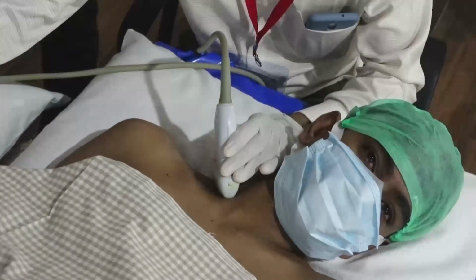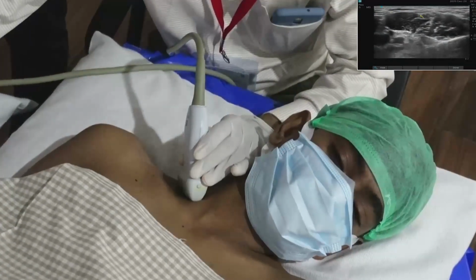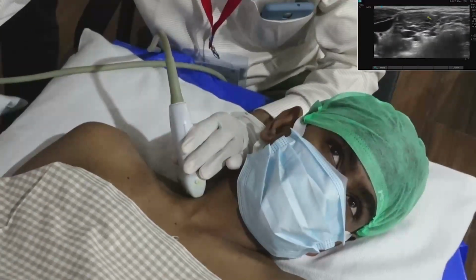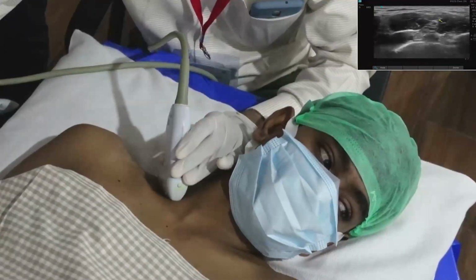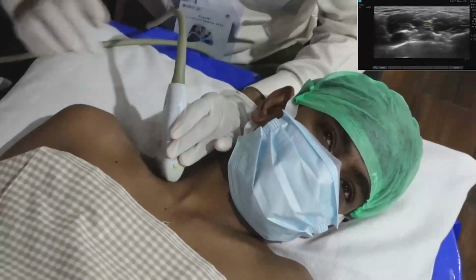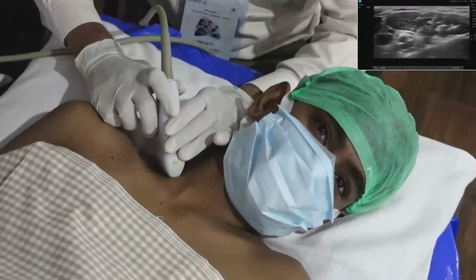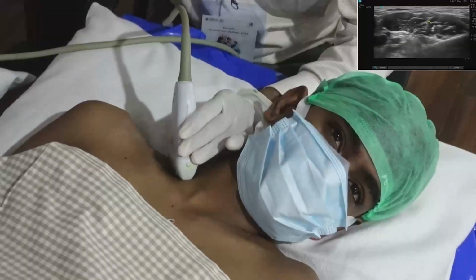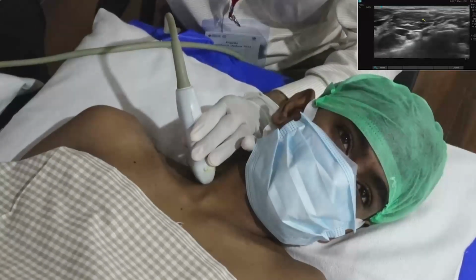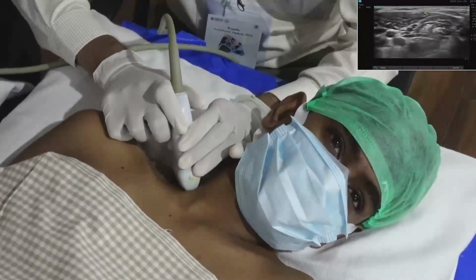Because the more and more you move away from the phrenic nerve, which lies over the anterior surface of the anterior scalene, if you move the neural elements further down, the chance of getting phrenic nerve palsy is less. Definitely the incidence is less when you give upper trunk. So now this is the C5, C6 combined together forms the upper trunk.